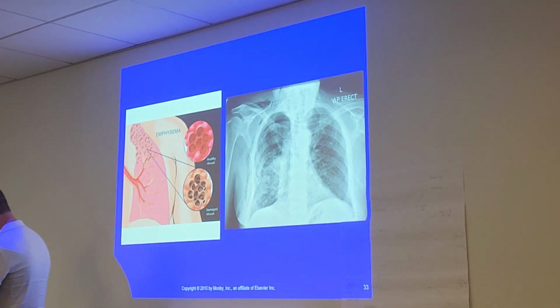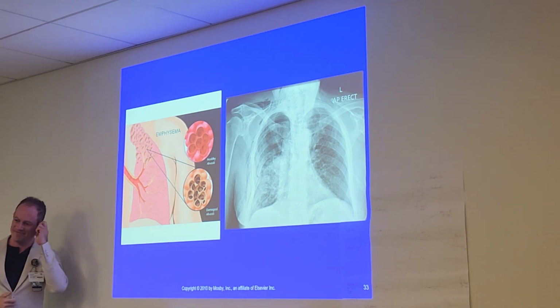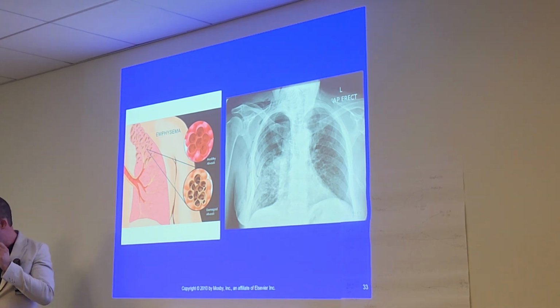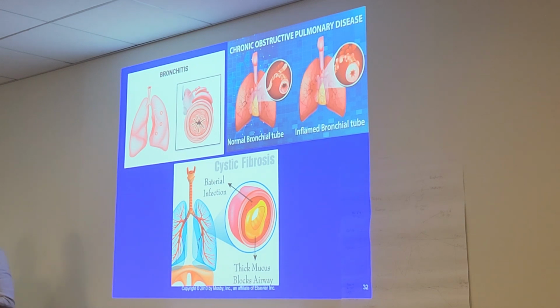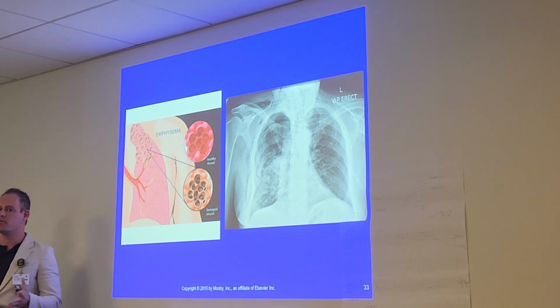So the other thing that we were discussing, the bronchitis, the COPD, and the cystic fibrosis, would you go up? Well, it depends. Those first two, that's not really going to affect your image that much. But the last one, if there's mucus present, we increase because there's more tissue. Mucus becomes thick, like pus. So that's part of that critical thinking. Think about the pathology. Think about what it's doing to the tissue around it, and that's how you would adjust your techniques. Is that making sense? So what would be the opposite of osteoporosis? Since we're already talking about all this.